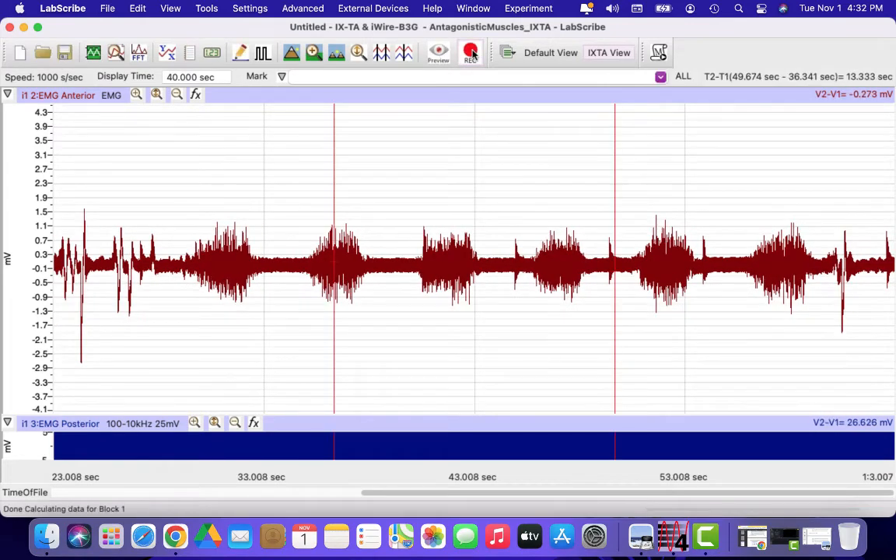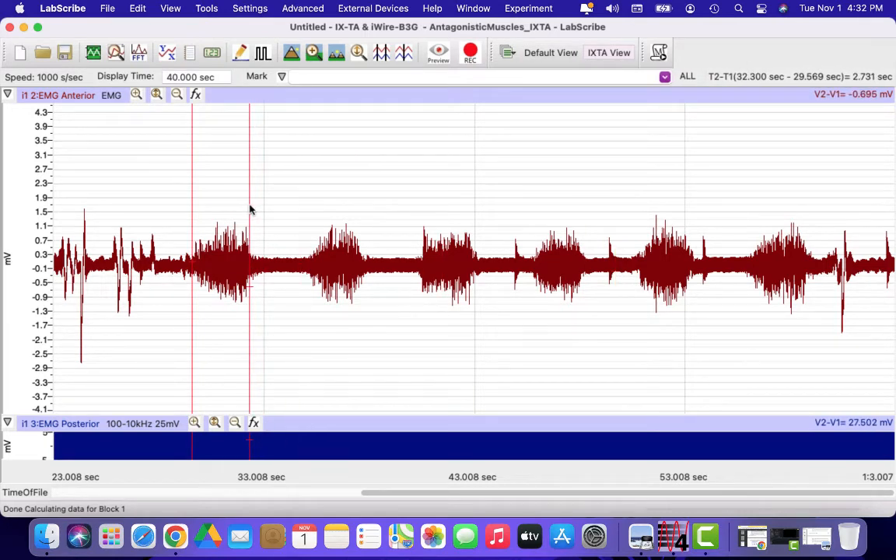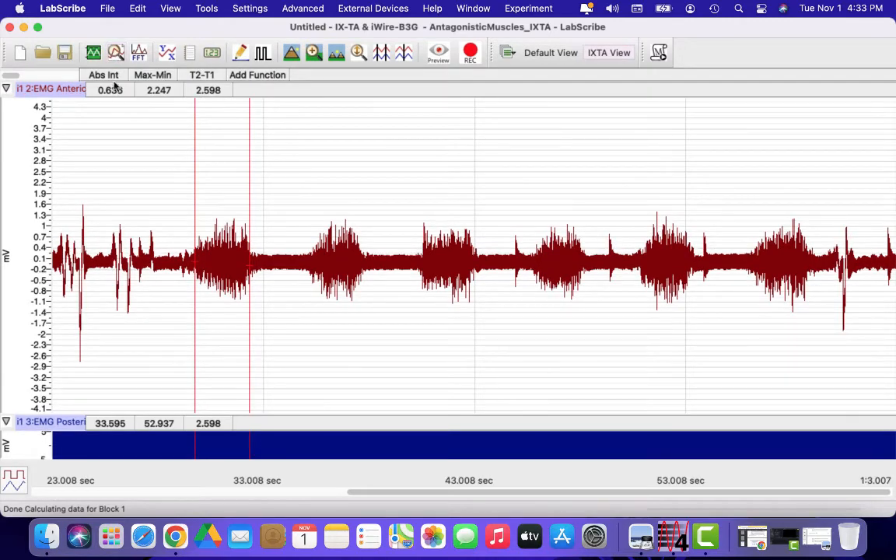I'm going to stop my recording — here are my specific muscle bursts and that's exactly what I want to see. To take measurements, I'm going to use my two cursors, the two red lines. You can click and drag them anywhere you want on the screen. I'll put them at the beginning and end of a burst of activity, then go up to the Analysis tab. That gives me the absolute integral — the number underneath gives us the amount of muscle activity during that burst of contraction.